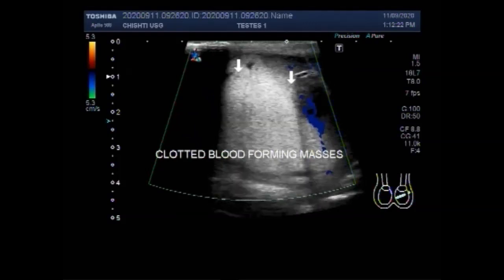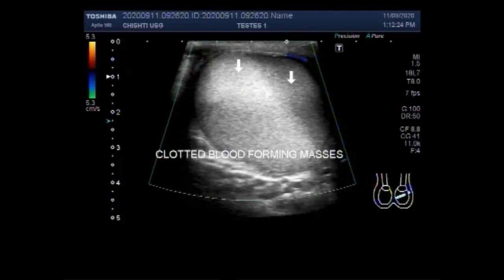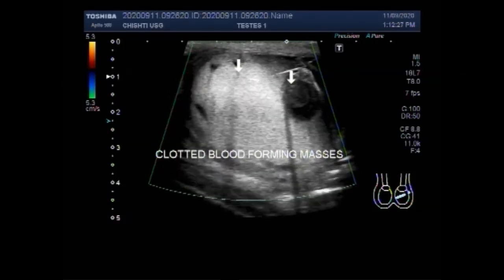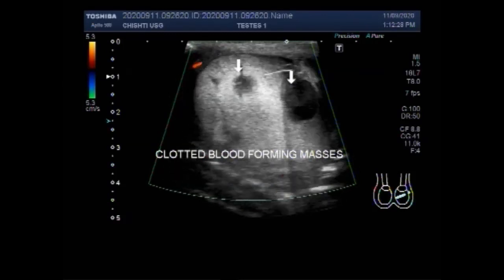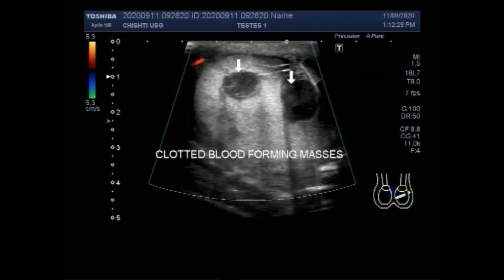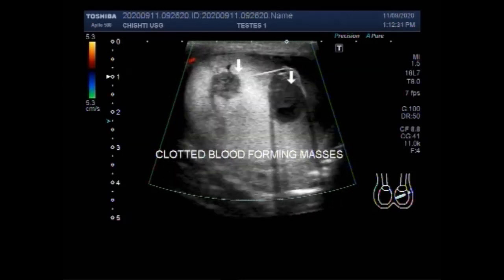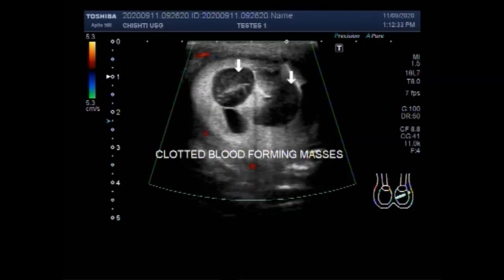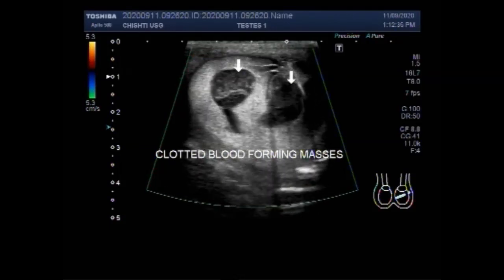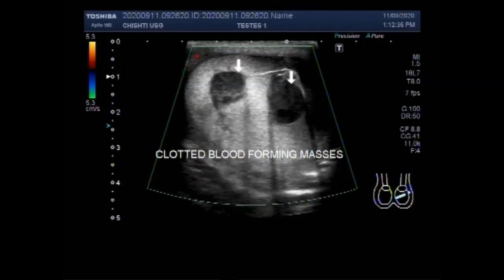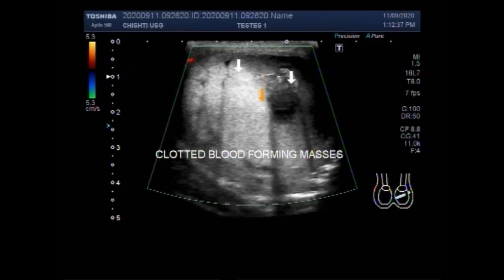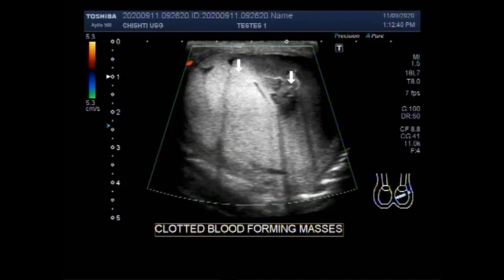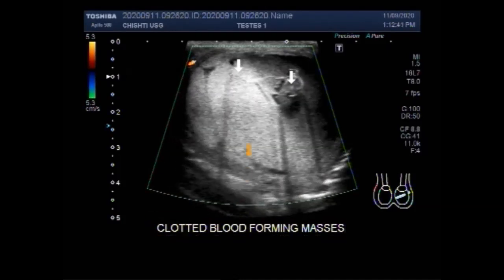After trauma, the scrotum is often tender to touch, which makes scanning difficult. An attempt should be made to evaluate both testes and epididymis to identify any extra-testicular collections.